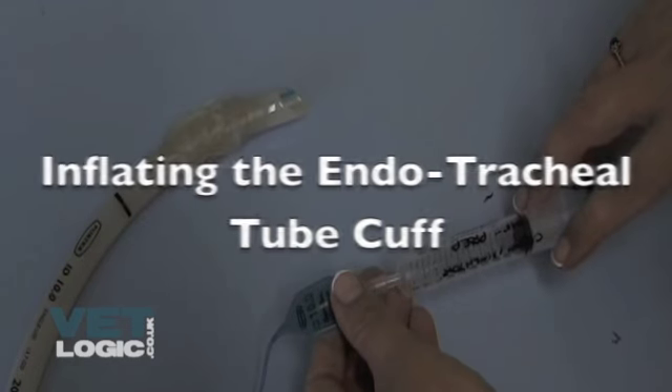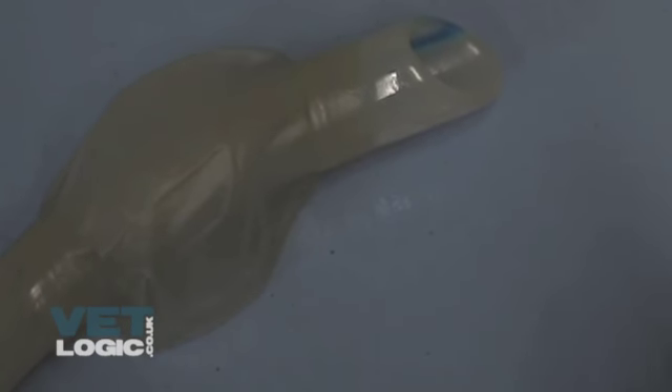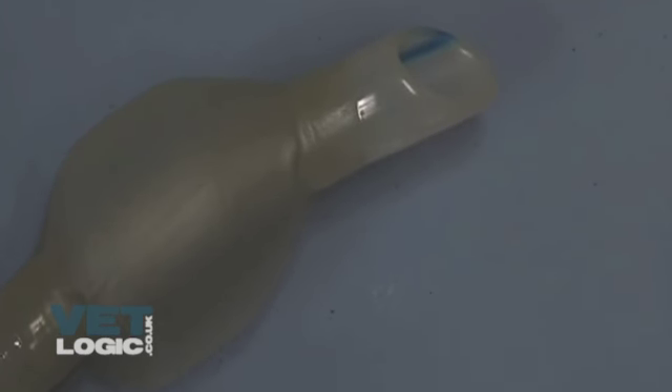To avoid over-inflating the cuff and causing tracheal wall necrosis, we try and incrementally increase the volume of air in the cuff just enough to stop any leak of gases around the cuff.